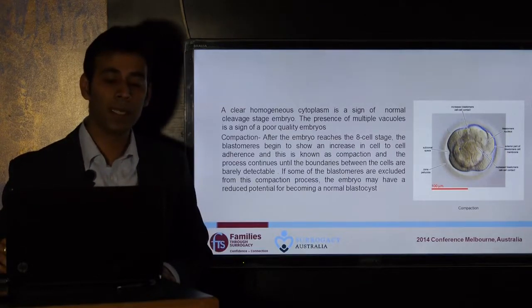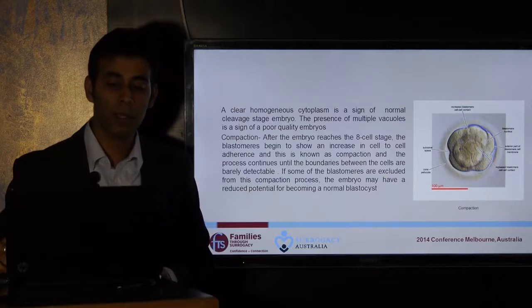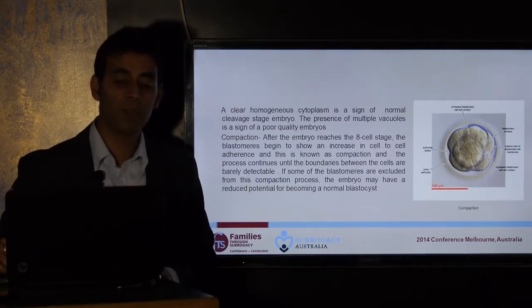Cytoplasmic homogeneity is a sign of normal cleavage stage embryo. The presence of multiple vacuoles is a sign of a poor quality embryo.